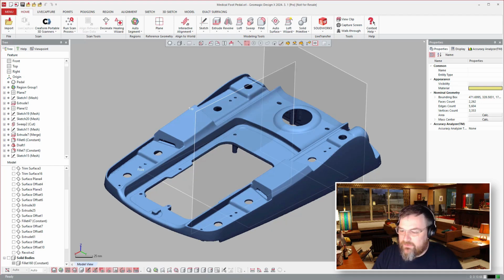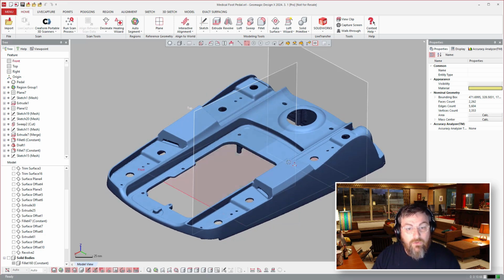As usual, the structure of this demonstration is not for me to use the software and do all the modeling, although sometimes as an AE, I can't resist actually showing some of the features and doing some of the modeling. But really, it's highlighting the fact that these are history-based models within the software, so I can roll back and look at the approach of how this model was created inside of Design X.